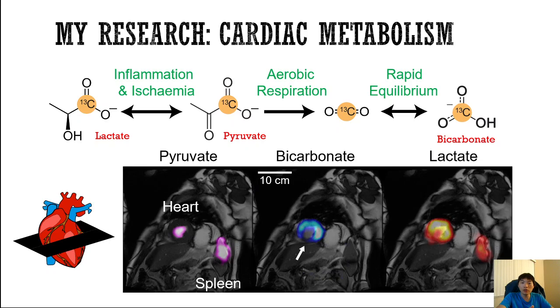And so this is a patient who recently experienced a heart attack. With this technique, we can predict whether the muscle that is affected by the heart attack is viable. And if it's not viable, then this tells us that doing interventions to restore blood flow will not work.